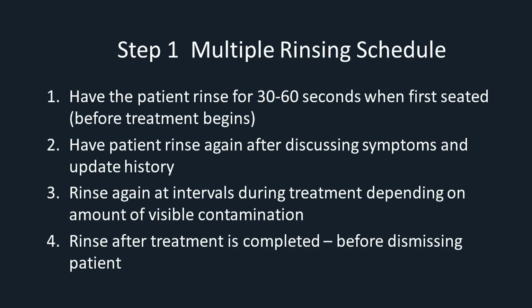With the rinses, it's very important to have a multi-step rinsing schedule. By that, I mean that when the patient first walks in the room, have them rinse for 30 to 60 seconds with the antiseptic mouthwash, and then seat them in the chair and talk to them about medical history, talk to them about their grandchildren and their pets, whatever you need to do. And then right before you start treatment, have them rinse again. What these 2 rinses do, the first rinse will really knock down the number of viral particles. We do have, again, a study on bacteria. It will knock down bacteria in the mouth and in the aerosols by 40 to 80%.